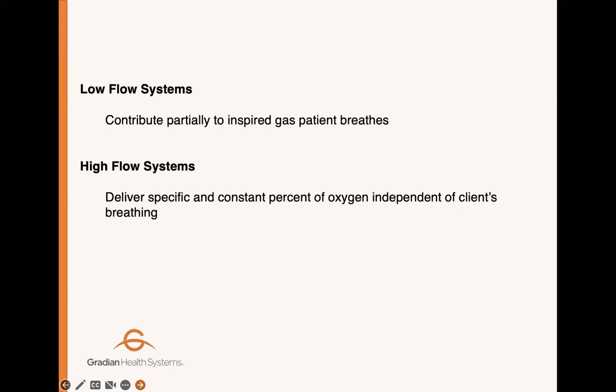So we have low flow systems and high flow systems. Low flow systems contribute partially to the inspired gas where the patient breathes, and high flow systems deliver a specific and constant fraction of inspired oxygen, independent of the patient's breathing. So when you are giving therapy, we start with the low flow system and go to the high flow system. Next.